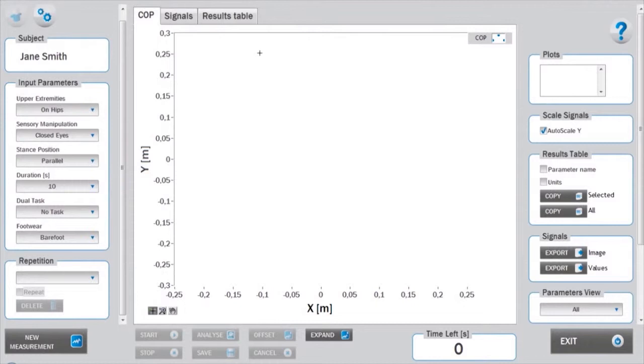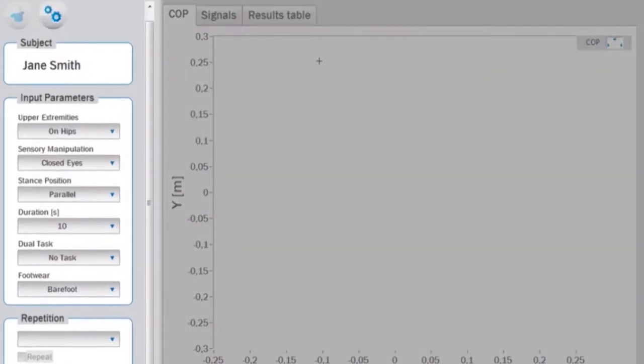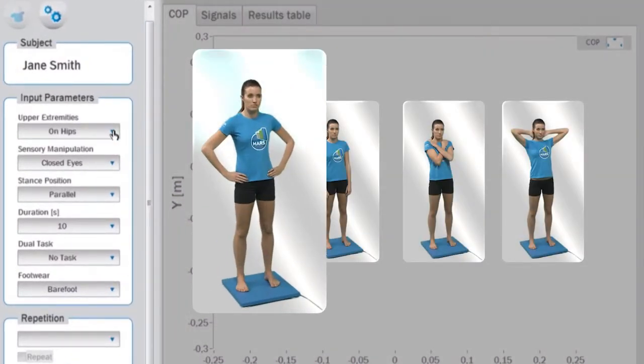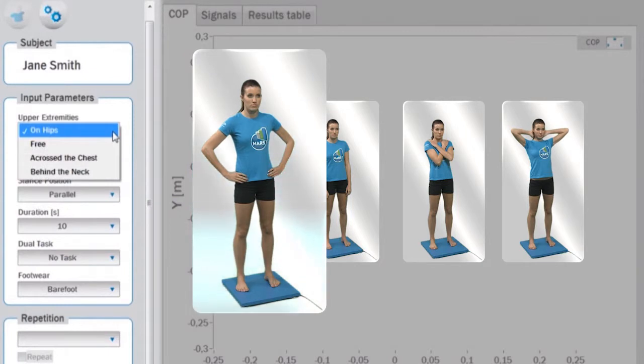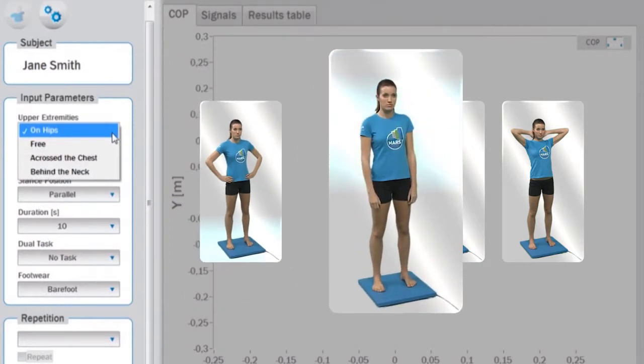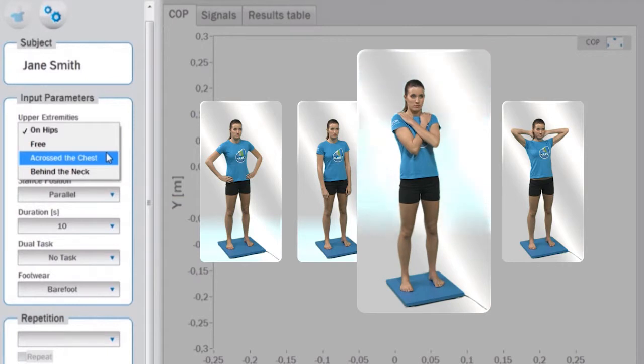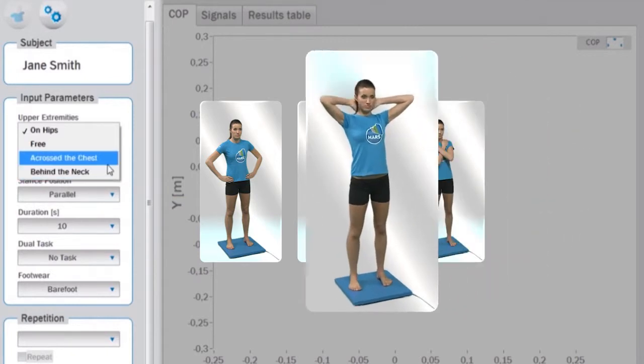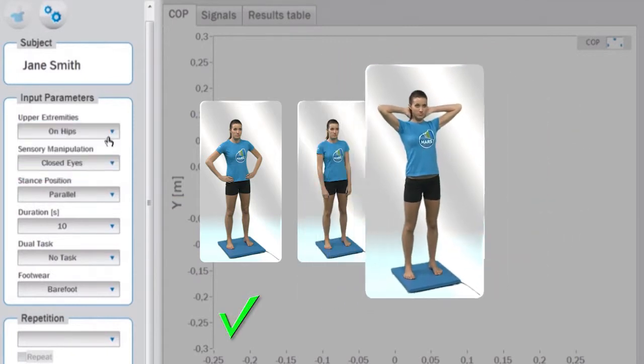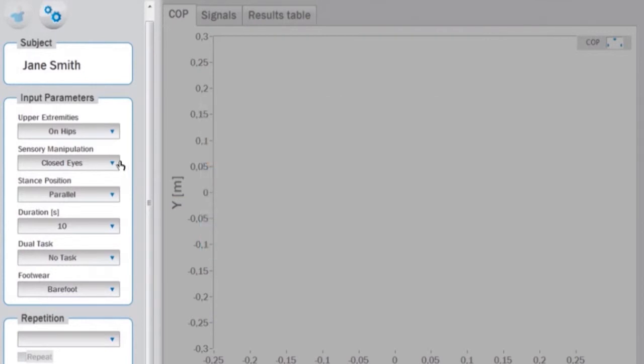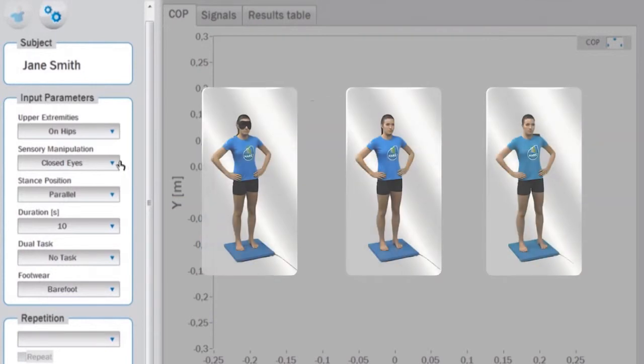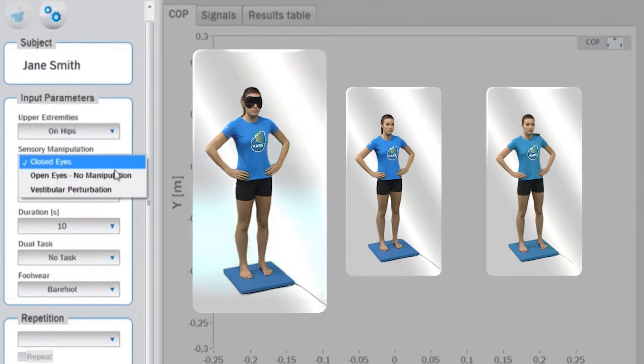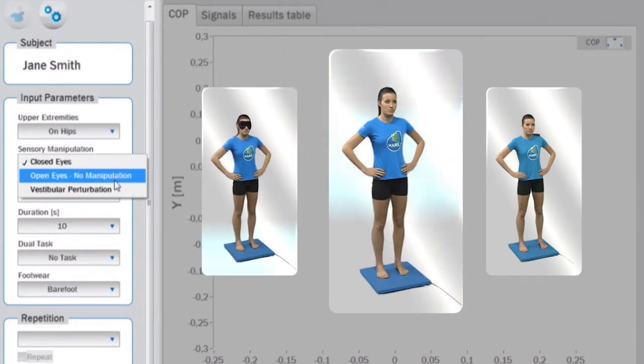These are upper extremities, where you can choose among hands positioned on the hips, hands free, across the chest, or behind the neck. Afterwards, select the sensory manipulation where you can choose among closed eyes, open eyes with no manipulation, or vestibular manipulation.